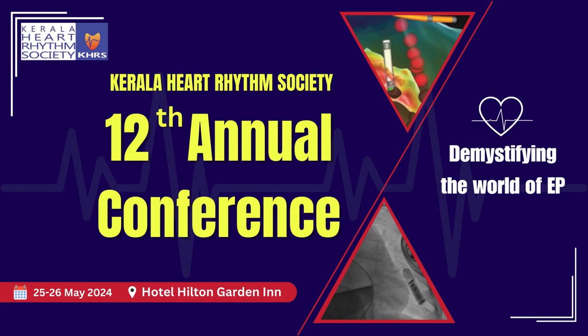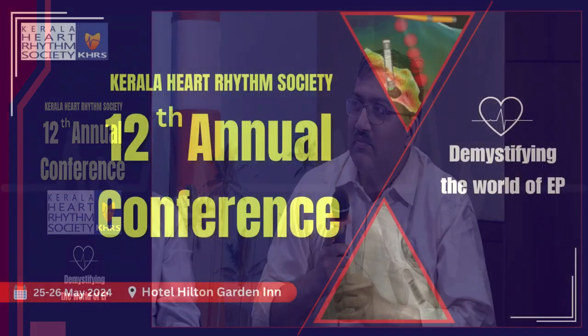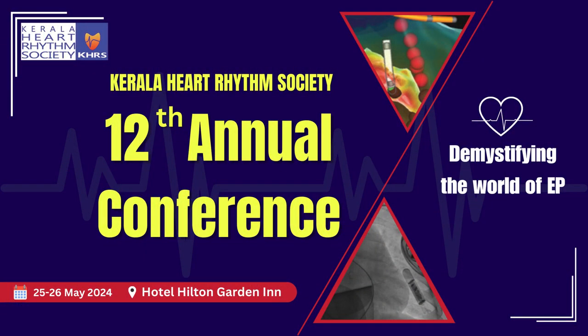Thanks, nice talk. One thing, we can do a voltage scanning also. If you do a scar map, you can change the voltage and see different voltage areas. Just by scanning, you will get an idea of how the scar is. Yes, and then you can decide on further high density mapping. You can start off with 0.5 as a cutoff for scar, and you keep scrolling down. Once you start getting channels, we will get the channels inside the scar.